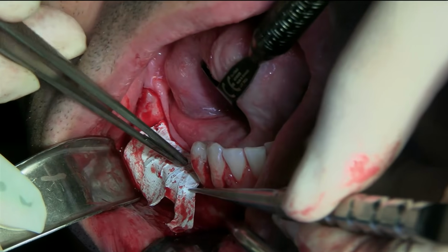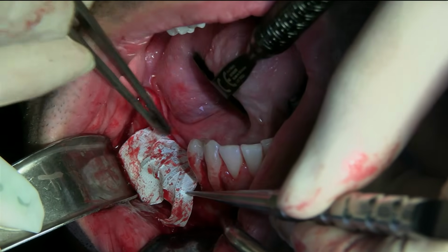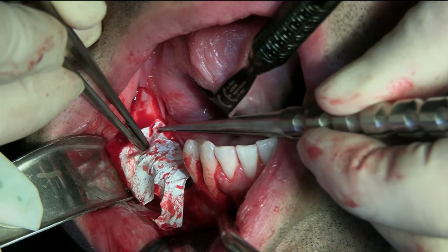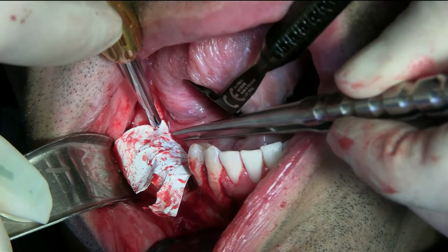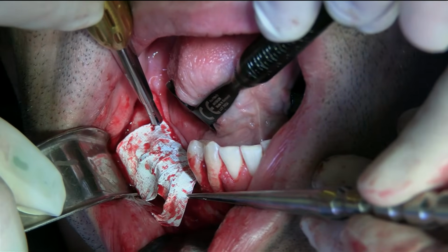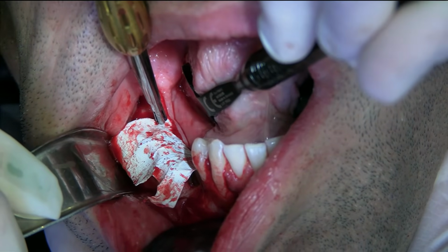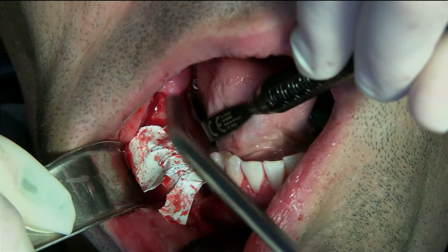And ready? Here we go again, tacking. Just relax. There we go. So second take we did it.